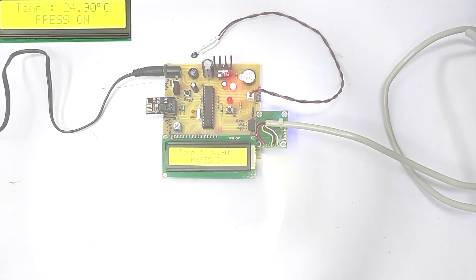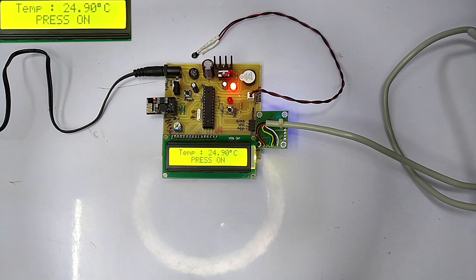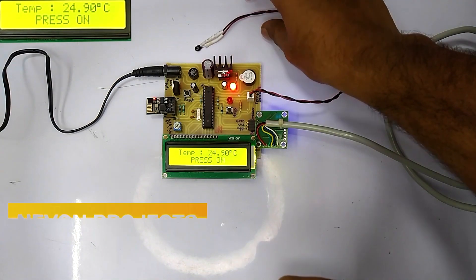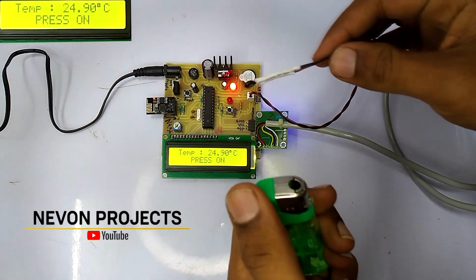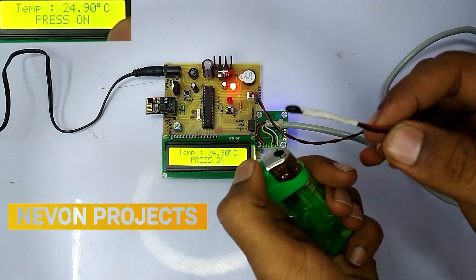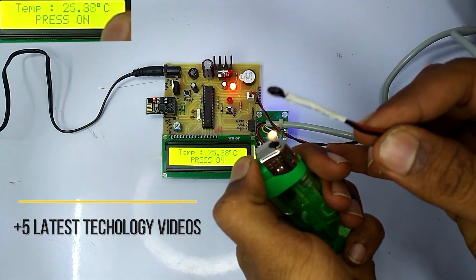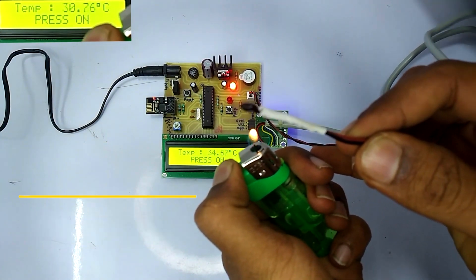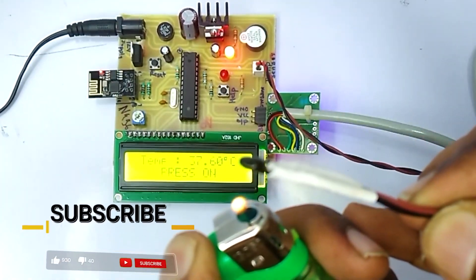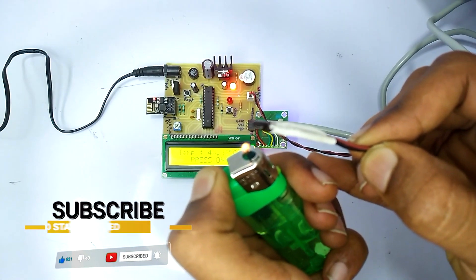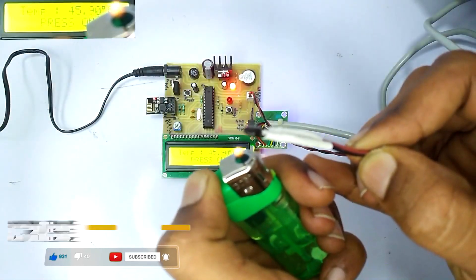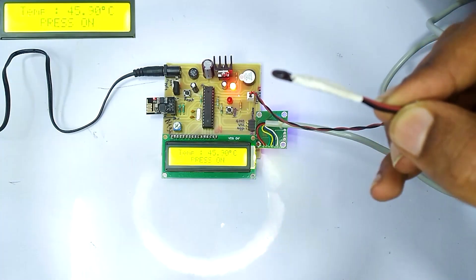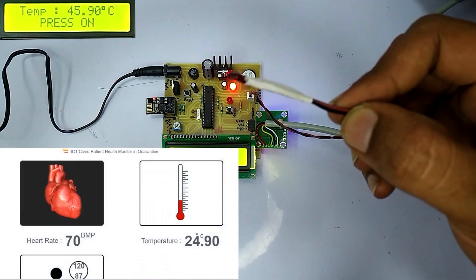To check the temperature, we are going to use the temperature sensor connected to the system. To showcase the temperature rise, we are going to light the lighter in front of the temperature sensor. As soon as the flame comes closer to the temperature sensor, the display shows the temperature rise and it is uploaded on the IoT.